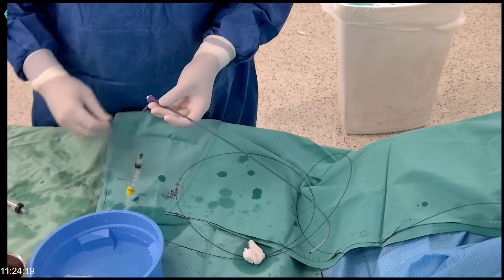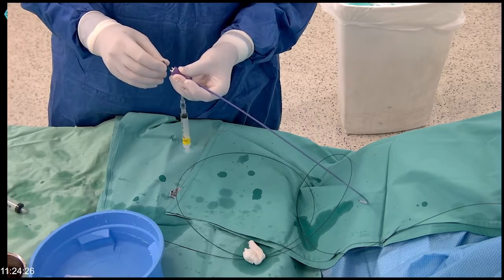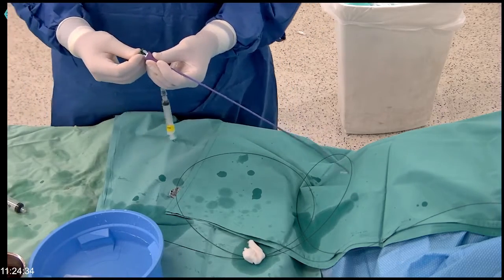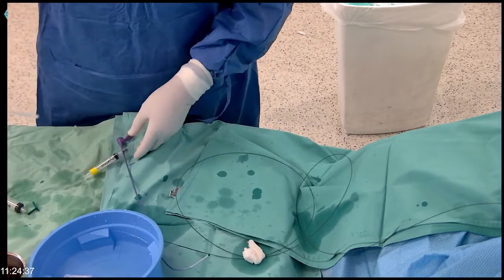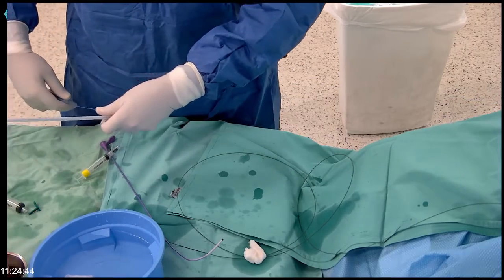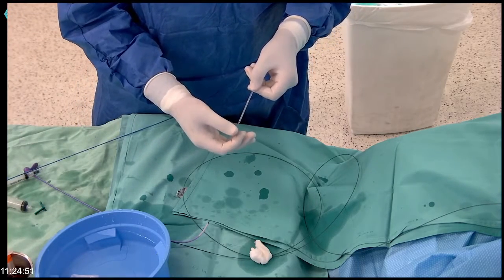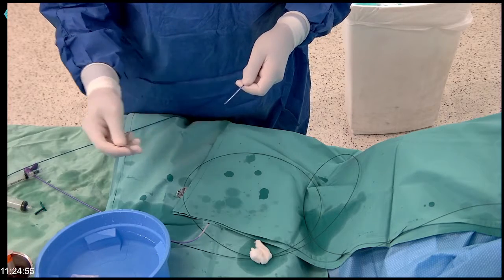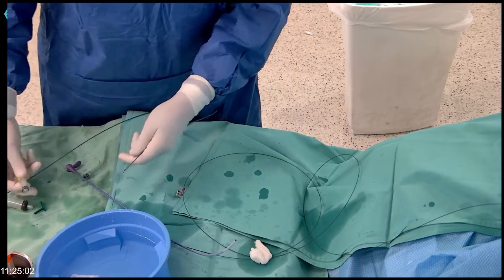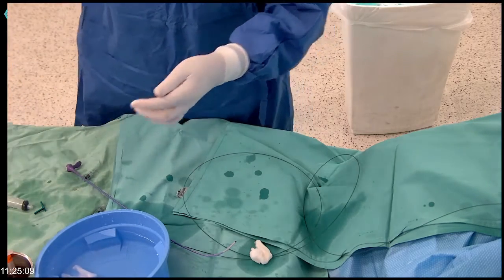One very important step is to break the one-way valve so when we insert the reducer we have minimal friction. We break it several times with the green dilator. Next, we take out the reducer from its protective plastic tube. The reducer comes with a distal metal mandrin and a plastic cover — both removed. I check that the reducer is well located between the markers, flush the lumen of the reducer and delivery system, and set it aside — it is ready.